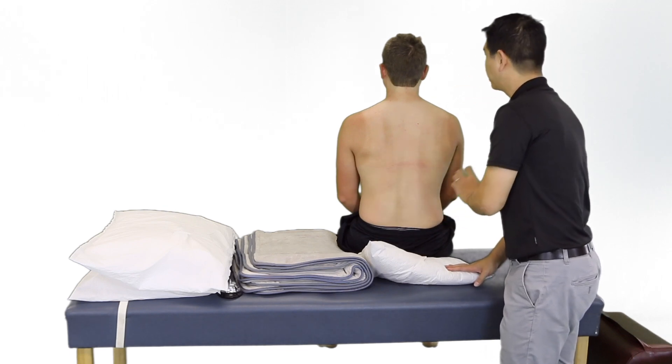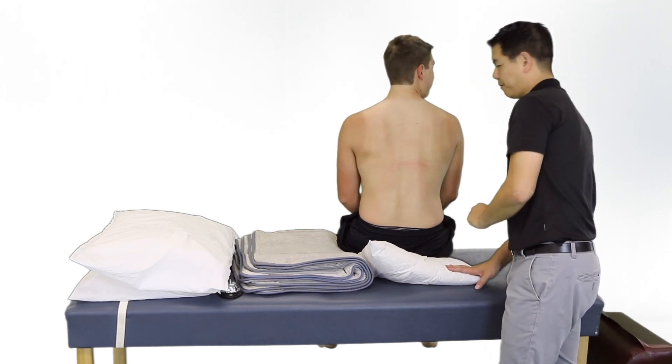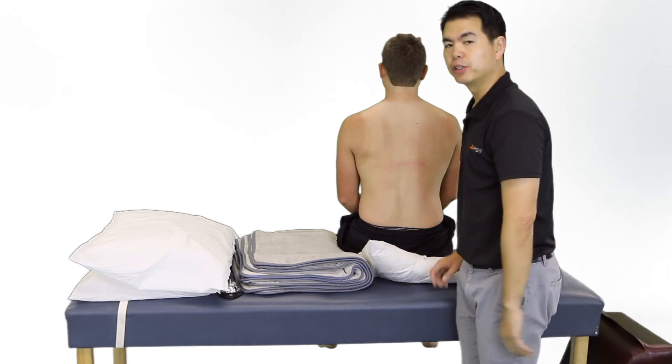We are again going to ask the patient if they are feeling okay, and once they confirm they are feeling good, we can conclude the treatment.